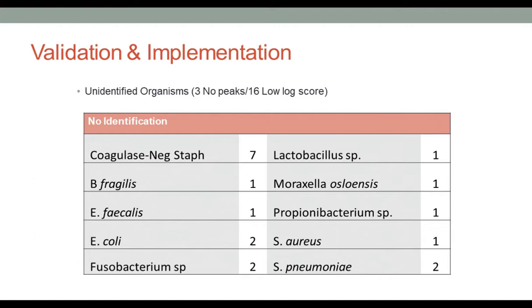Well, this identification method is from a culture, so you're not replacing the culture. You're just doing a rapid identification from that culture, and so you still have your blood culture bottle. You still do your gram stain. You subculture your bottles and those types of things. For us, we do the gram stain. We get those results to the physicians immediately as a critical value, and then we do the Sepsityper.